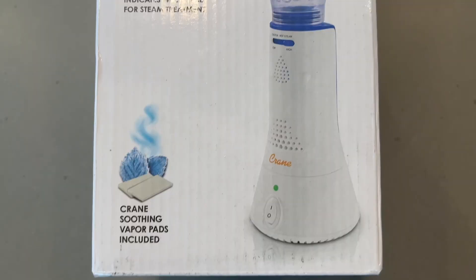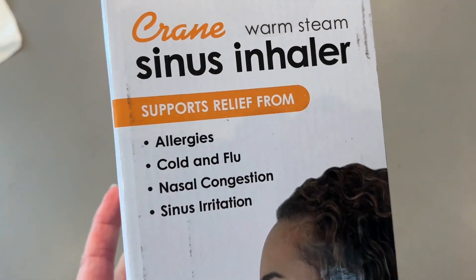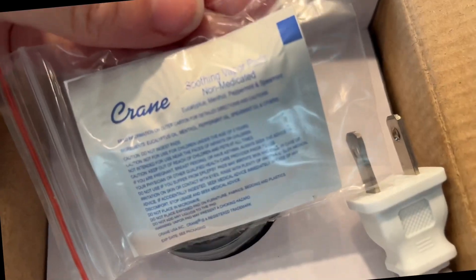If your throat is dry or you need sinus relief, you'll want to know about the Crane Handheld Personal Sinus Inhaler. It comes with a soft and comfortable mask, two packages of menthol-scented vapor pads, and an instruction book.